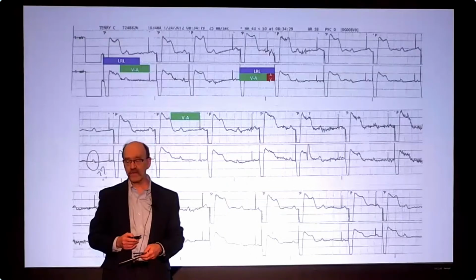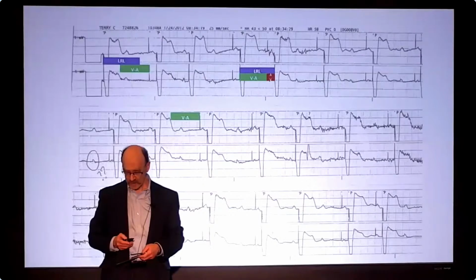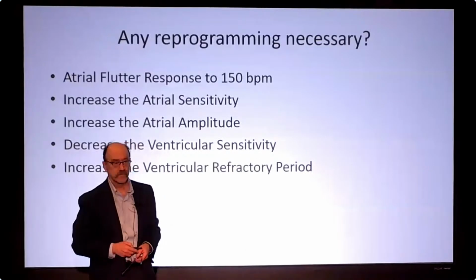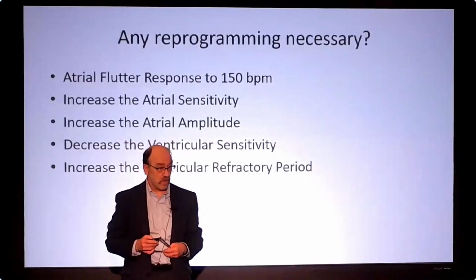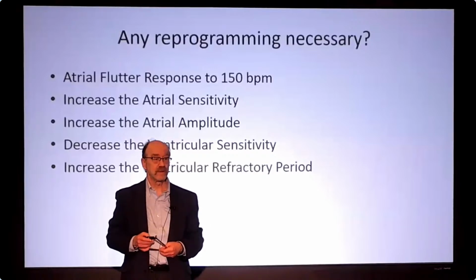So how would you get rid of T-wave oversensing? How are you going to fix the problem? Simple. What are you going to do? I heard it: you're going to program, change the event. What? You could increase the PVARP, and it wouldn't wind up pacing based on the ventricular activity. That's not going to help that much. What's the real problem?